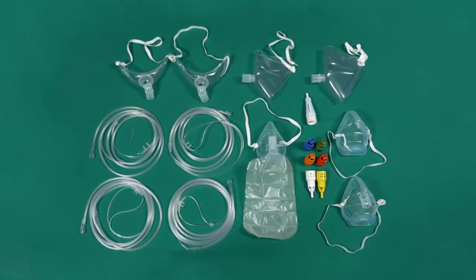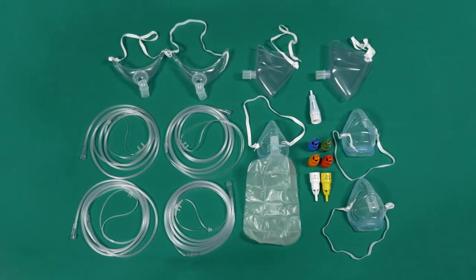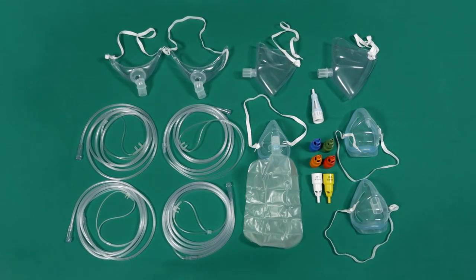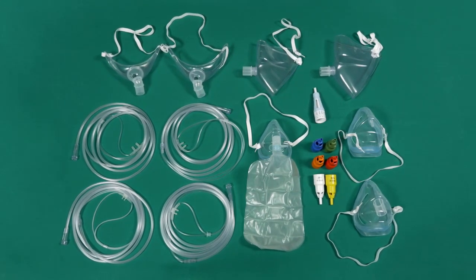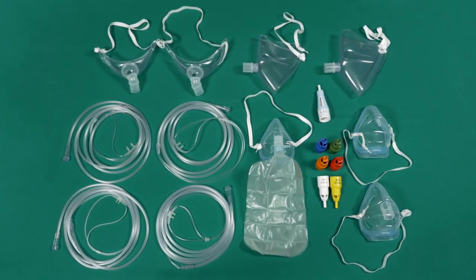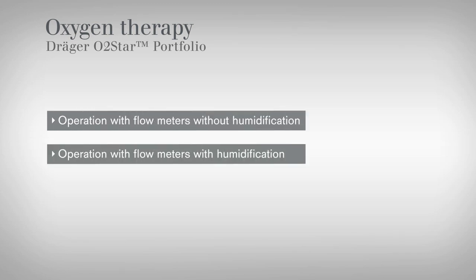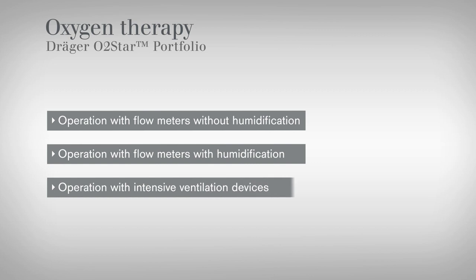This video shows you how to use the O2 Star Portfolio with flowmeters, intensive ventilation devices, and in combination with humidification. It explains how to prepare, activate, and operate the device. The video is divided into the following sections: operation with flowmeters without humidification, operation with flowmeters with humidification, and operation with intensive ventilation devices.